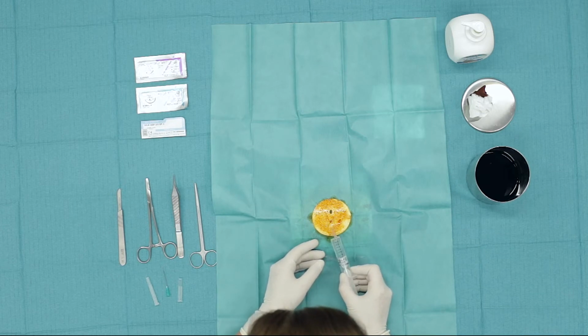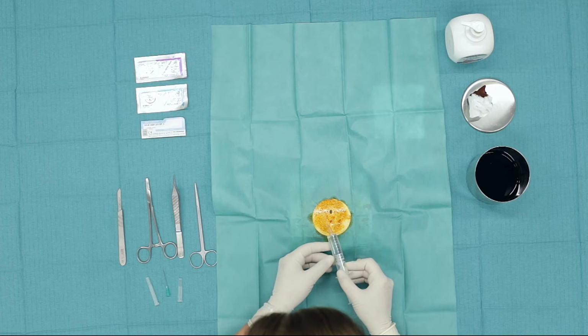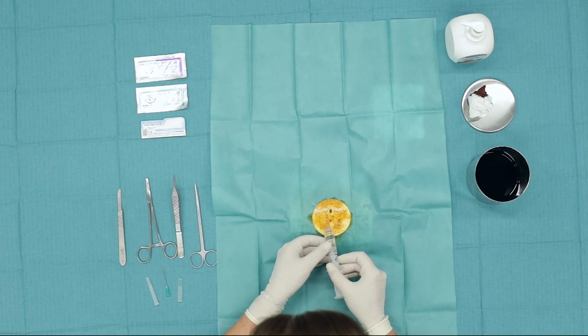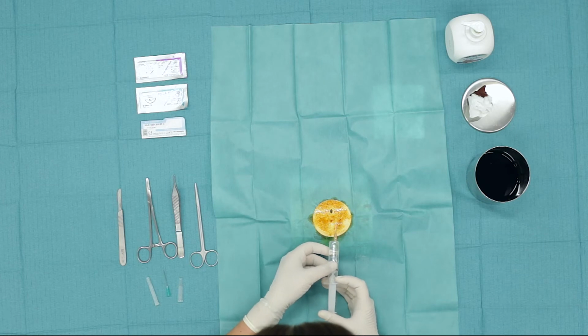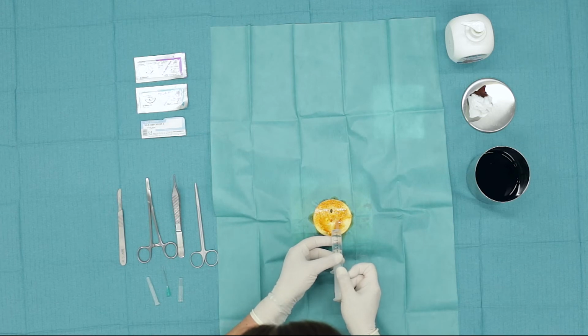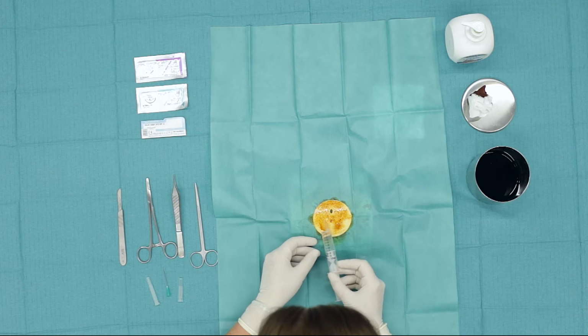This means that in order to cover the whole surface anesthetically, we will puncture again from this point where the anesthetic has already been administered, and we will proceed in parallel, again with a 45-degree angle, suction and administration of the preparation with parallel withdrawal of the needle. In the same way on the other surface, the angle is always 45 degrees. The suction proceeds and the gradual administration of the formulation with parallel withdrawal of the needle. In this way we anesthetically cover the entire surface.